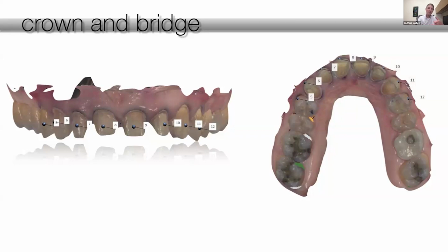If it's 1.5 millimeters deep, that's when I use a different tool. I will switch to impression material because I can push down there. With scanners, again, it's a beam of light. You can't retract tissue with a beam of light.